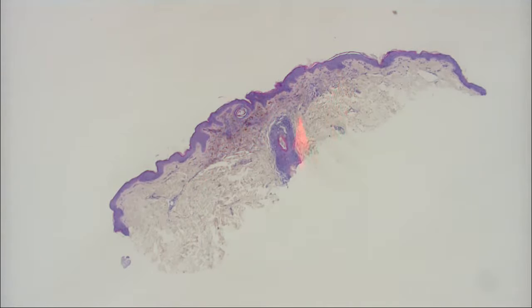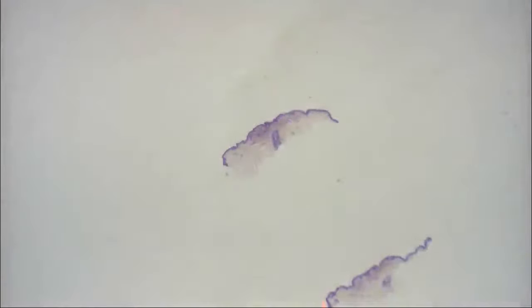So did you think this was an inflammatory or a neoplastic process? Neoplastic. Good, perfect. Benign or malignant? I was having a little bit of difficulty with that. Let's apply the benign criteria then. Look at this bird's eye view here. This is like an eagle's view.